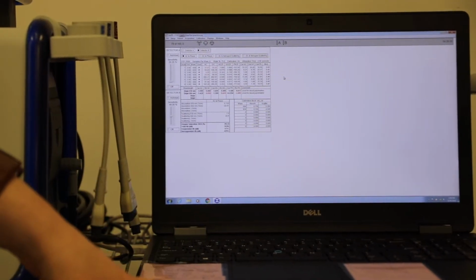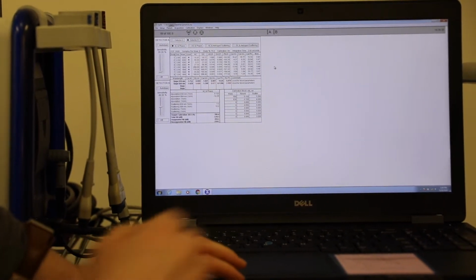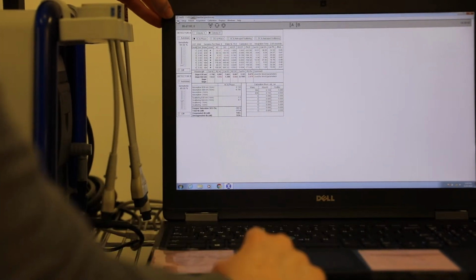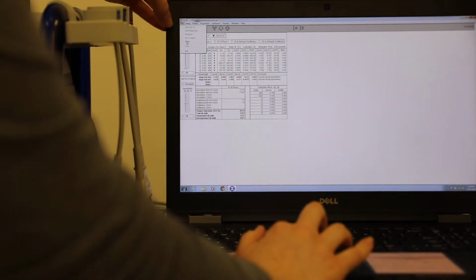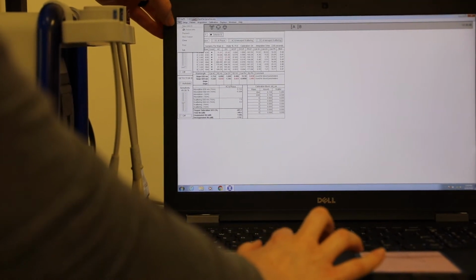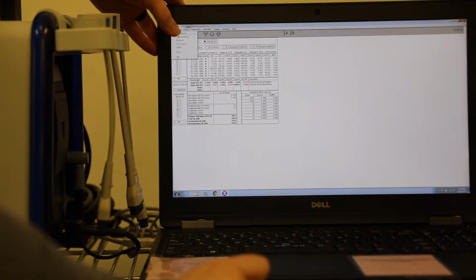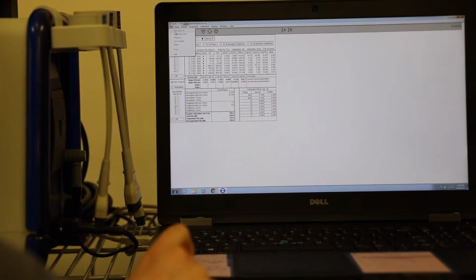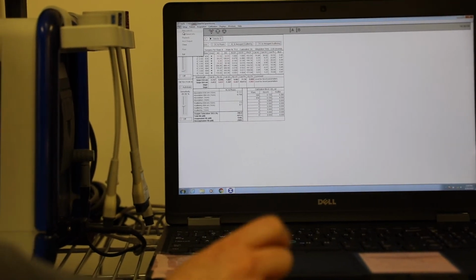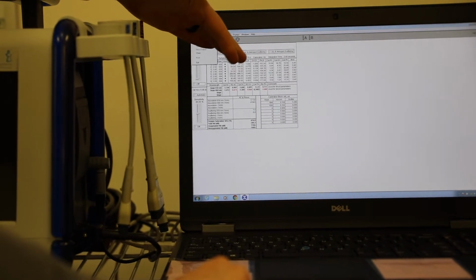So now that the NIRS is calibrated, to start collecting data for a subject, we want to come up here to File, and it's not going to let me do it because I already did it, but you'll click on New and it'll bring up the window that you can type in a file name and save it, and that's where you just need to enter the subject's ID and the date that you're doing these tests and click Save, and then it'll bring you back to this regular screen.